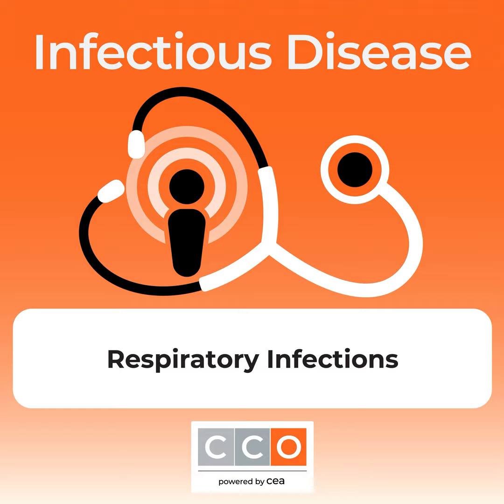Viruses, I would say the two main holes in these panels, they don't detect, at least in their current version, SARS-CoV-2. So obviously that can be important. And they don't detect CMV. So having a negative assay on either of these panels doesn't rule out infections due to those organisms. And in fact, if you look at a recent French multicenter study of ICU patients, they found that 21% of the bacteria that they isolated in BAL cultures were not detected by their FilmArray pneumonia panel, just to show. So when you get negative results, you do have to take this in context.